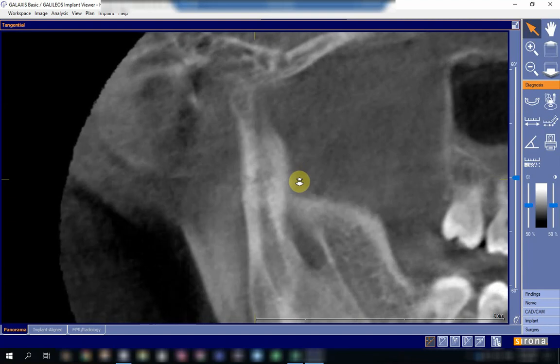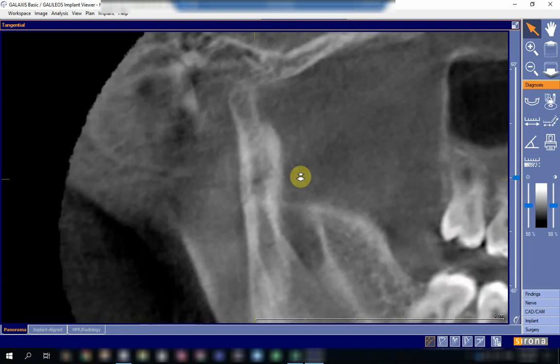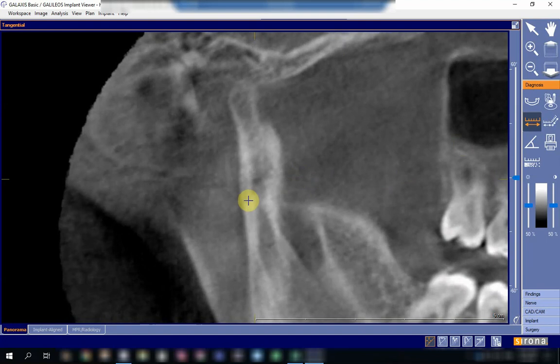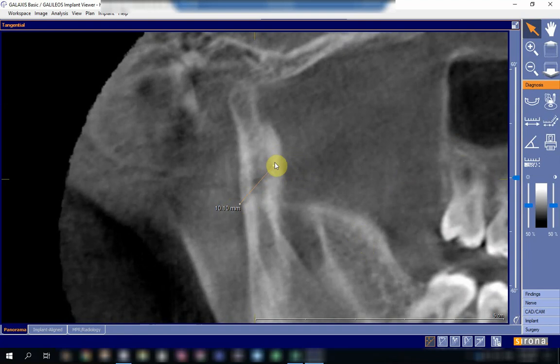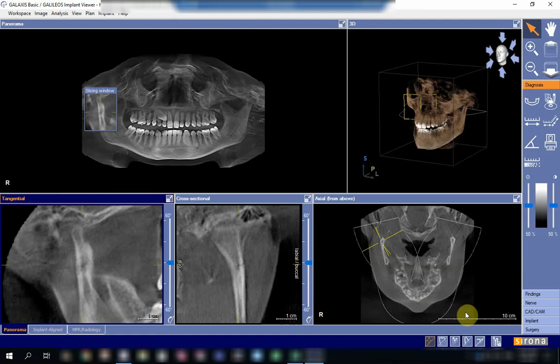Actually no. The fracture is extending — let me measure it — from here to here. The fracture extends around ten millimeters, but it doesn't go all the way through the whole thickness of the condylar head.